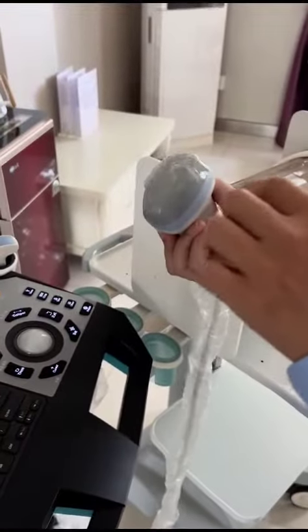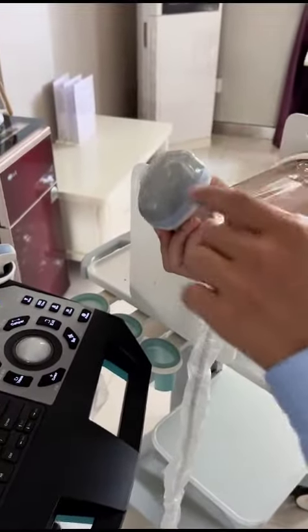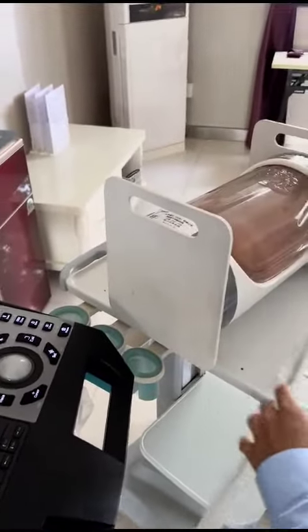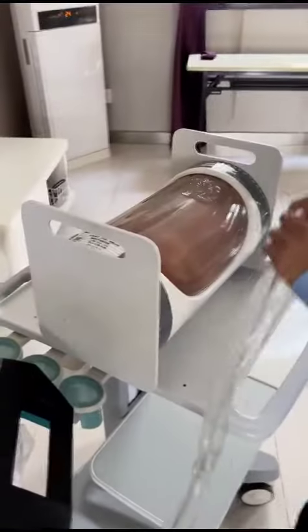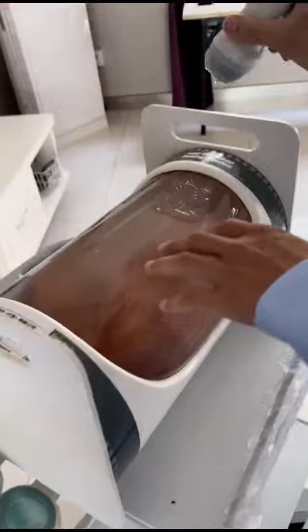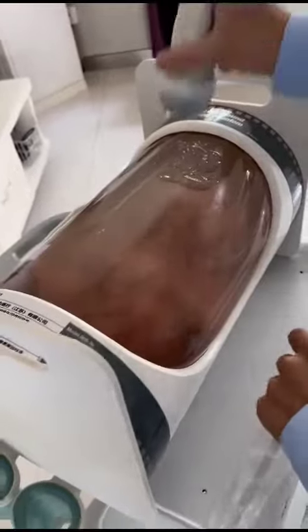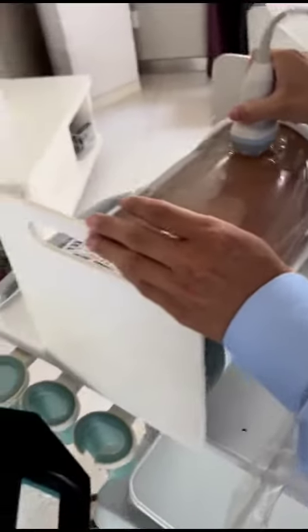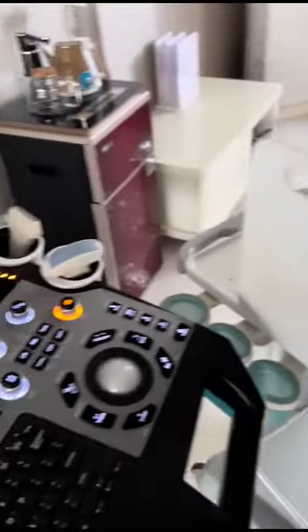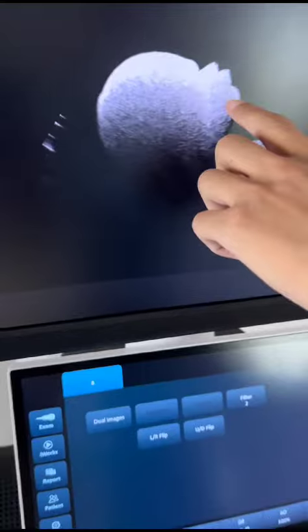Then put some gel on the probe interface. Now this is the fetal model. Rotate the probe to find the fetus's face, nose, and mouth.